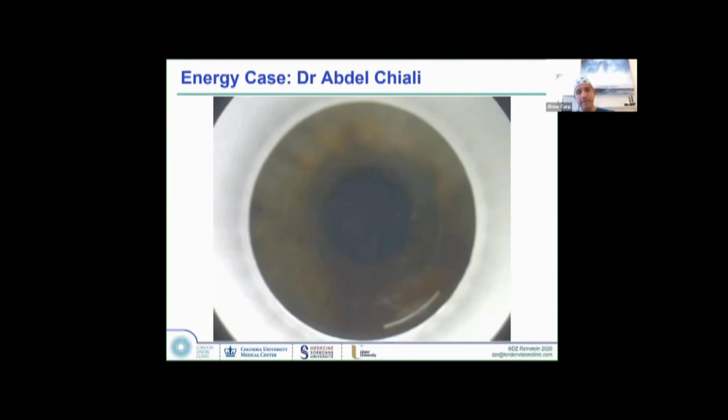And at that point, if you've got a thick cap, you can opt to make a thin cap smile and repeat the smile. You should never repeat a smile at the same depth as the original smile, because if you create two lenticle cuts at the same depth, you have the high risk of creating slithers if there is a slight misalignment in the depth. So actually, Dr. CHIALI did that.